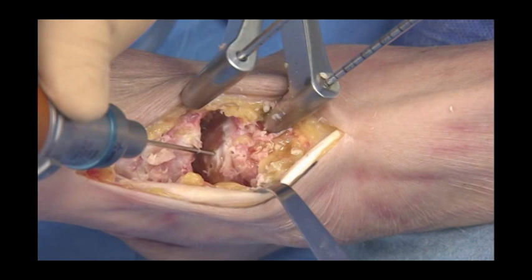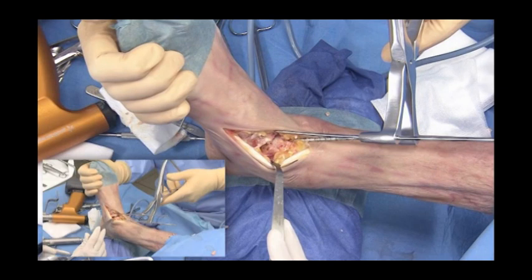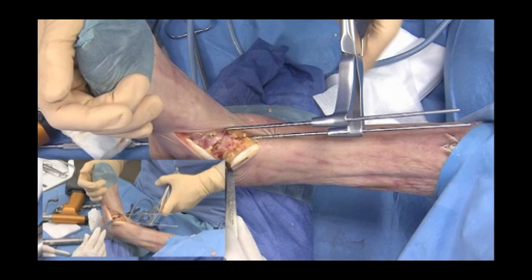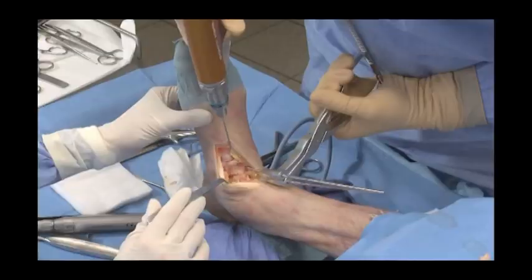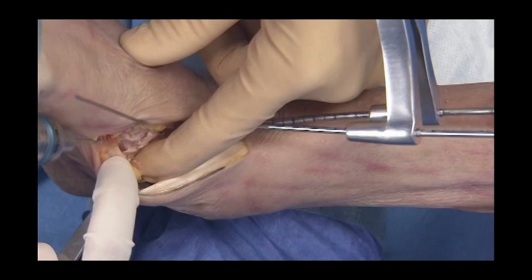The distractor is then removed and replaced with a hinged compressor while positioning the forefoot in relation to the hindfoot. The joint is then compressed and stabilised with two 1.5mm K-wires.